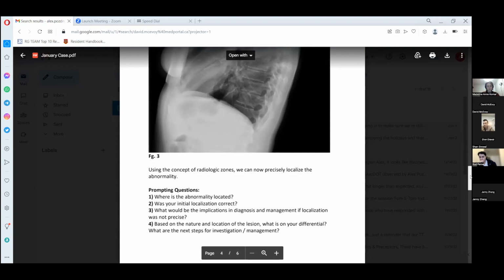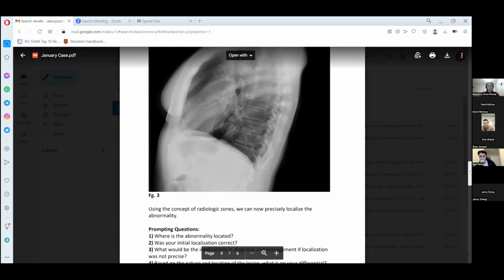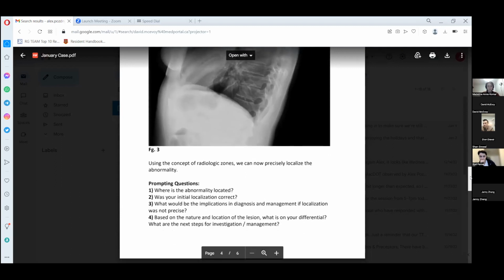And that's why it's important to always check back with the prior images that you have on file. So in clinical scenarios, it's always good to look for any priors. And this is always a right answer if you're prompted about what you would do further on investigation of this: always check your prior examinations.